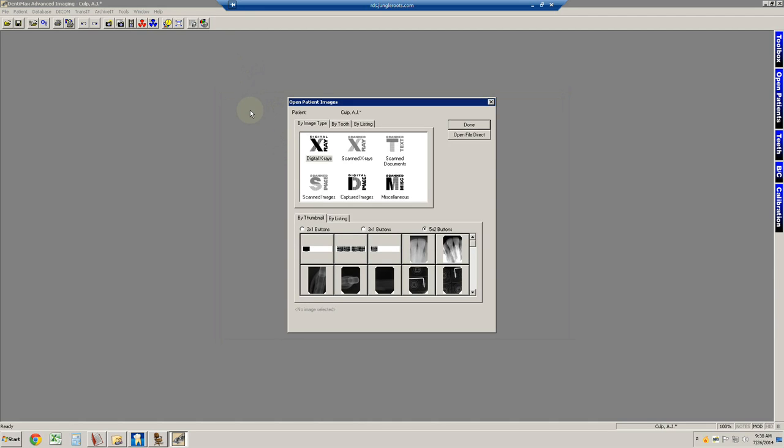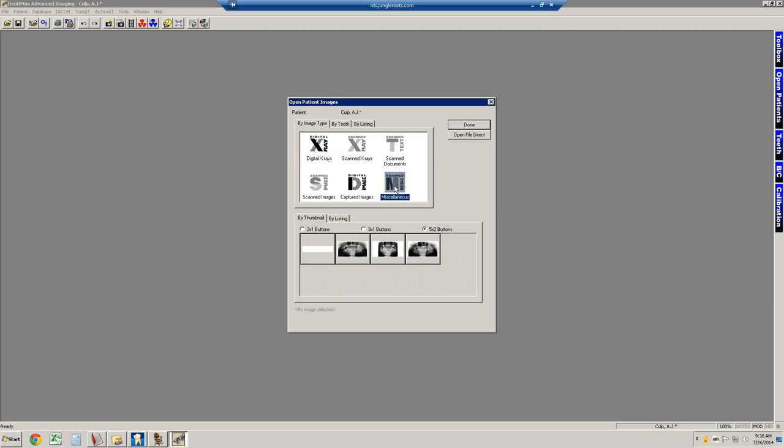Initially, it's asking for which images you want to open. The X-rays that are taken, intraoral X-rays, bite wings, periapicals, are always in this section. The miscellaneous section is always panoramic X-rays. And digital images are intraoral photographs or intraoral camera images that are provided by the hygienist for Dr. Culp to have additional information for JRCs, for example.